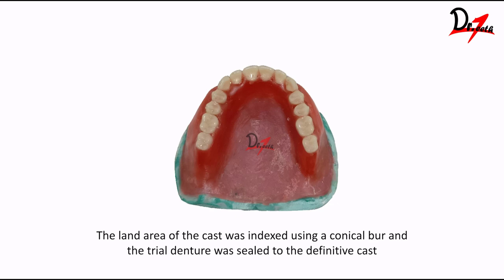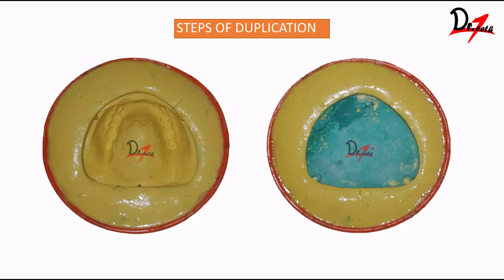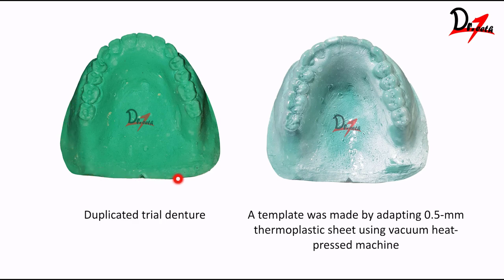We make three notches — one posteriorly and two anteriorly — and we seal our trial denture base. These notches will help us align the template we are going to make. After sealing it, we mix alginate in a rubber bowl and duplicate the maxillary trial denture base. This is our duplicated trial denture — you can see the notch here. On this, a template was made by adapting a 0.5 mm thermoplastic sheet using a vacuum heat-press machine. You can see we have adapted the thermoplastic sheet on top of it. These notches made in the original master cast will help align this template on the original master cast.